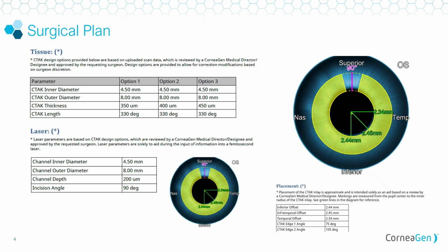They're going to tell you what the nomogram recommends, and then you get to choose your thickness. And the question is, why would I defer from what the thickness is there? It's based on the amount of flattening that you want and what that patient's preoperative refraction is.